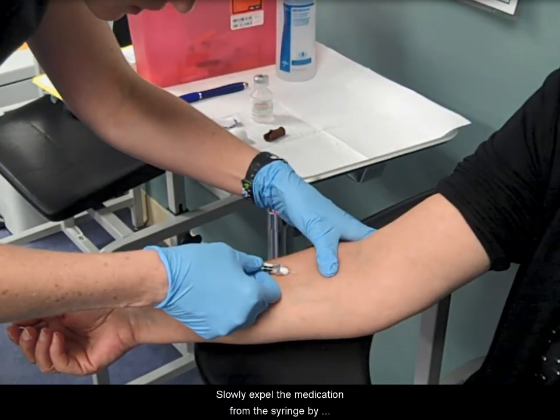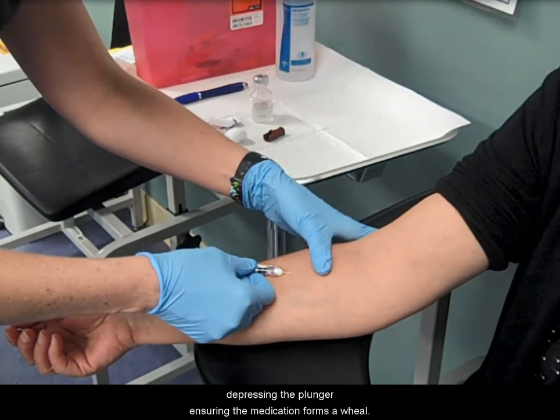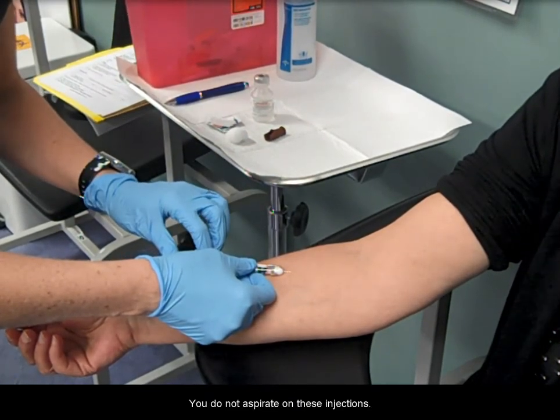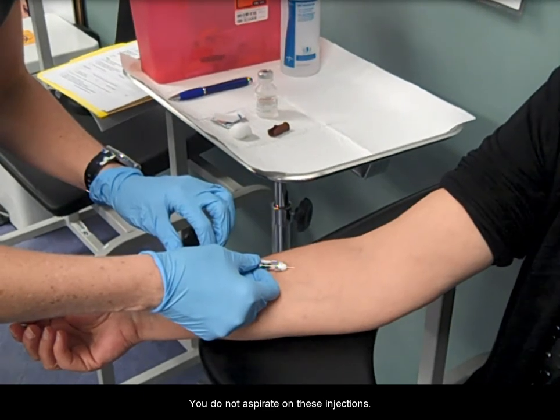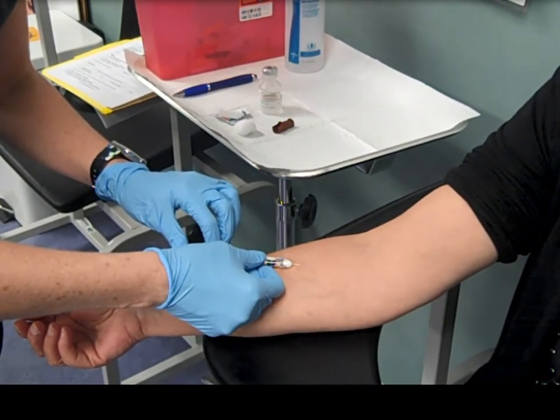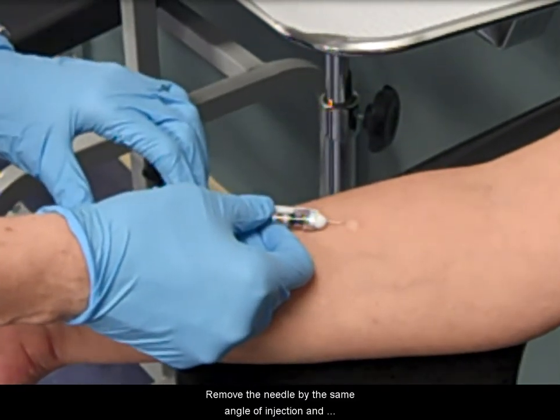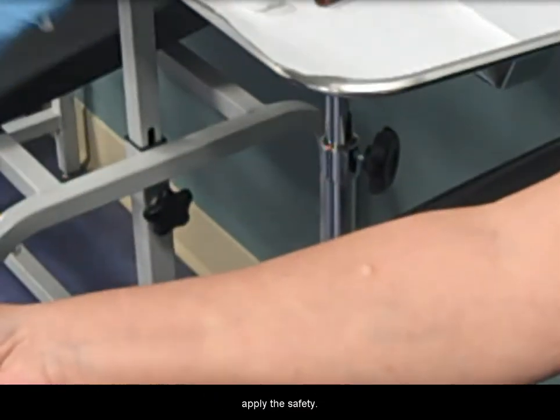Slowly expel the medication from the syringe by depressing the plunger, ensuring the medication forms a wheal. You do not aspirate on these injections.